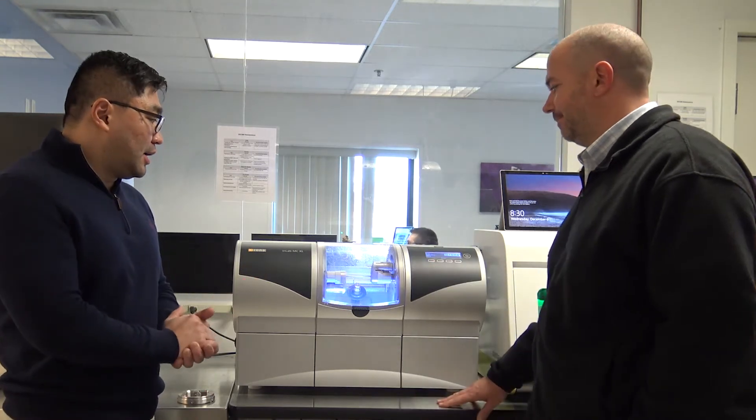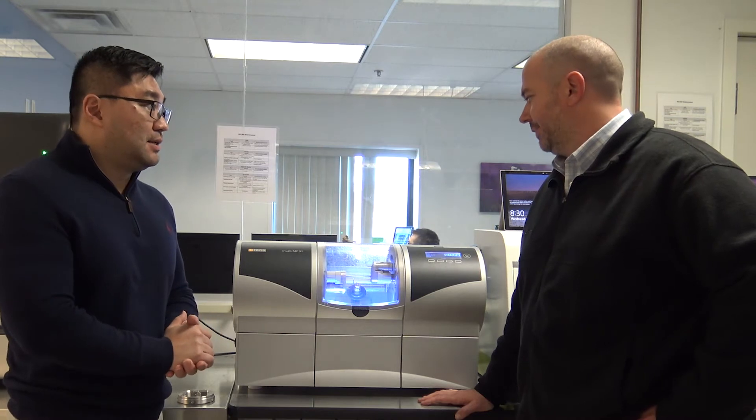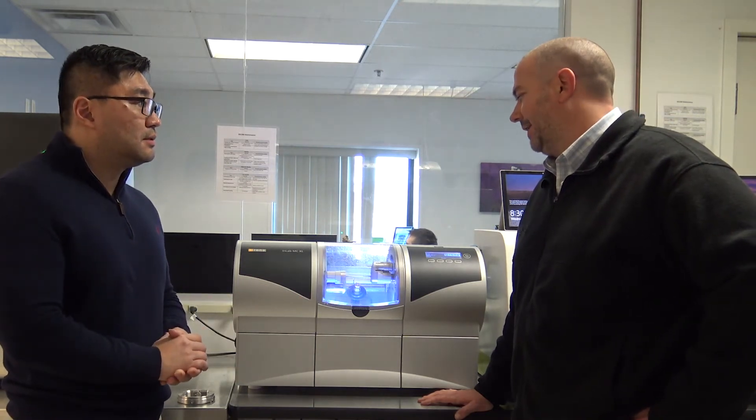Now Jay, I don't know if you've been asked this question before, but how long do the burrs last on average when you're milling Emax? I would say they last about just average 25 units per burr. 25 units per burr? Correct. Okay, awesome.